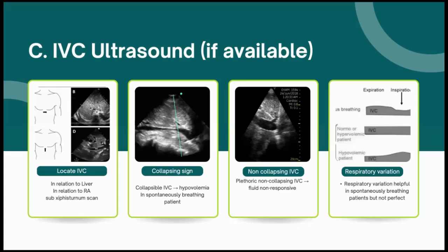Then you can see a diagram where you will see the collapsibility and the distensibility of the IVC. Those are very simple things we all should be able to do. If you have any doubt, next time when you present, your presentation will be like this: when you do your pre-op assessment, you say his pulse index is this much. Let's say intra-op, if you tell the volume status like this, you can tell about your PI.